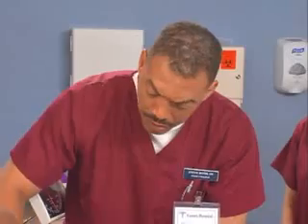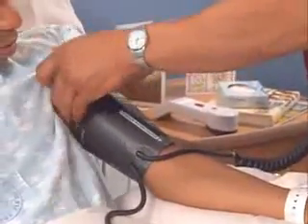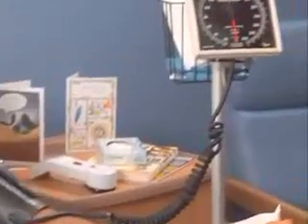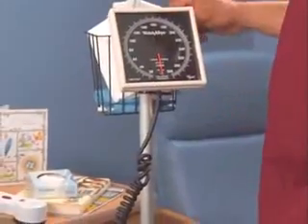How's that feel, Mr. Betts? Nice and snug. Good. So I'm going to raise your sleeve just a little bit more. And there we go. All right. Make sure the needle on the gauge is within the 0 mark. Got it. Okay. And Steve, would you put some conducting gel over the artery?